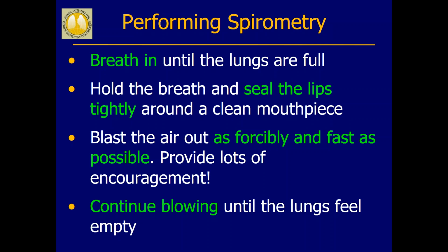So when you tell them to perform the spirometry, have them breathe in until the lungs are full, have them hold their breath, and then seal the lips tightly around the clean mouthpiece. Have them blast the air out as forcibly and fast as possible, and provide lots of encouragement. You almost have to be a cheerleader, right? You have to say, blow out, blow out, blow out. You have to be really helpful for them.